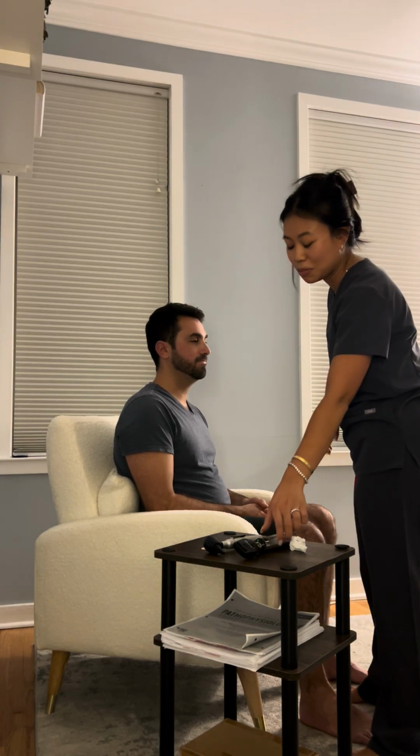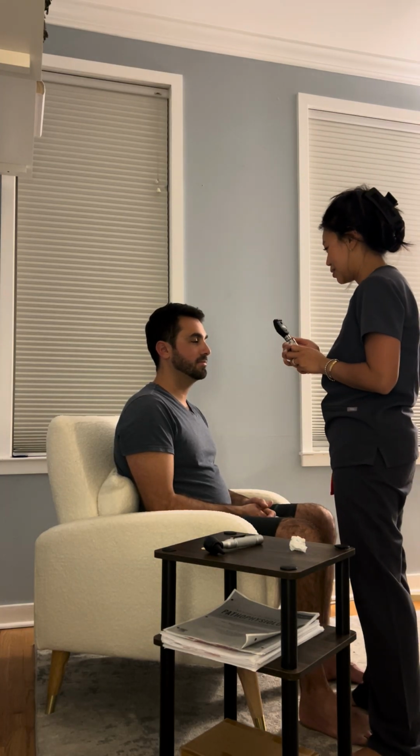I'm going to dim the lights. I'm going to use my ophthalmoscope. There we go.